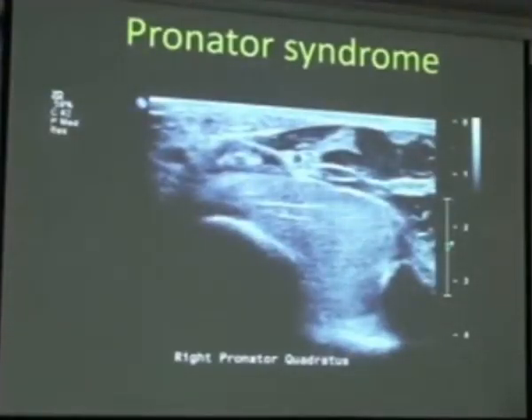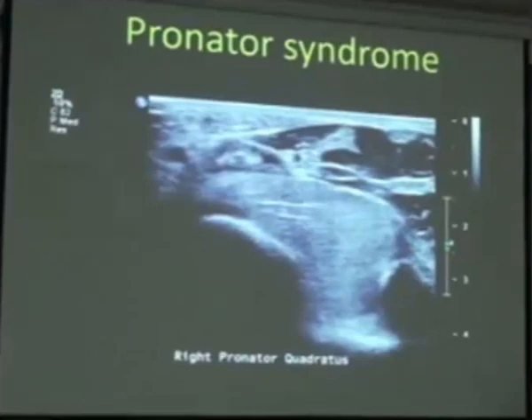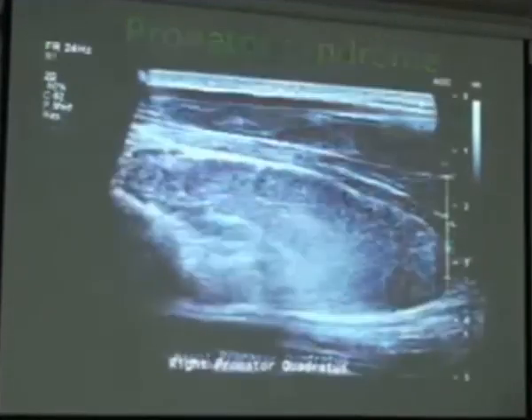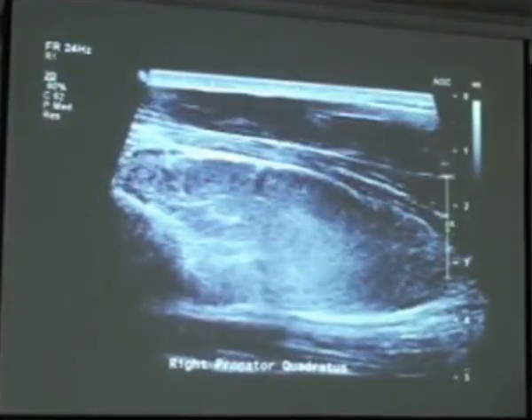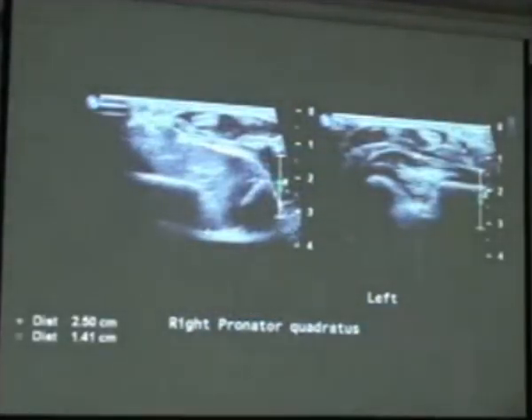Another condition seen on the volar aspect of the wrist is pronator syndrome. This gentleman presented with pain on the volar aspect of his right wrist after playing motor guitar. There is quite a bit of thickening of the pronator quadratus muscle between the radius and ulna. Using that comparative dual-imaging view, there's quite a bit of thickness difference between the right and left sides.